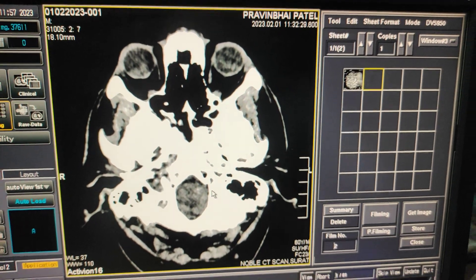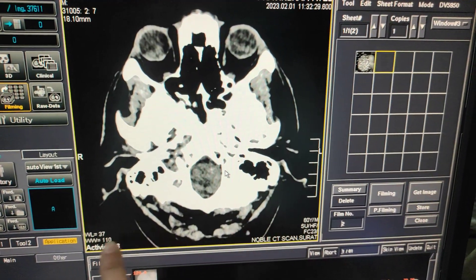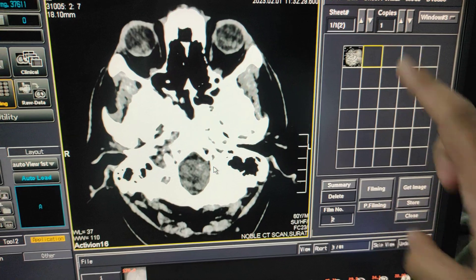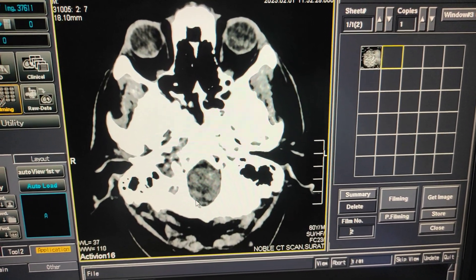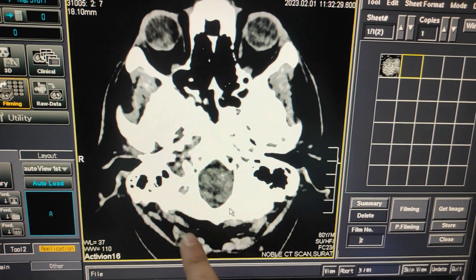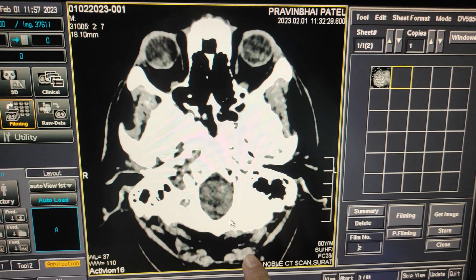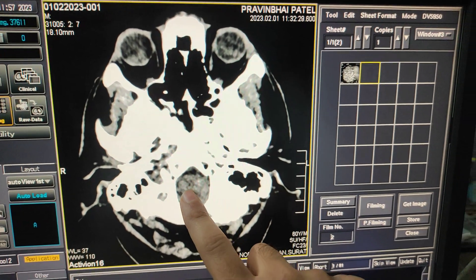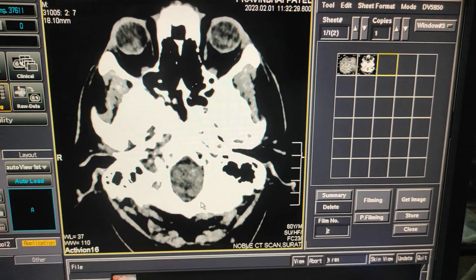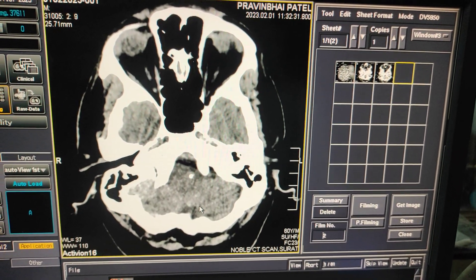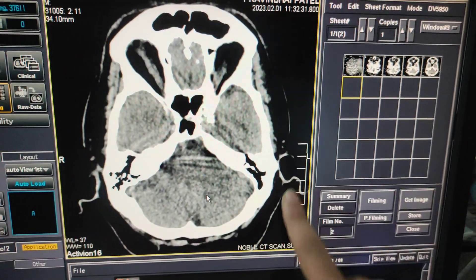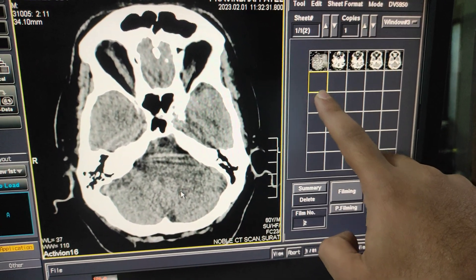Zoom the images according to this box — the images will appear in this box. This much zoom is enough. If you are cutting the soft tissue, that's okay, because for brain filming you need to see the anatomy from here only. Enter the first image, then keep entering — my zoom is according to this box, same to same, so the images will appear the same in the film.